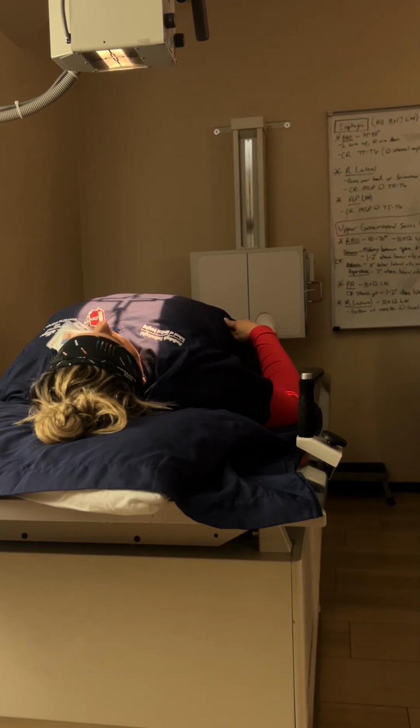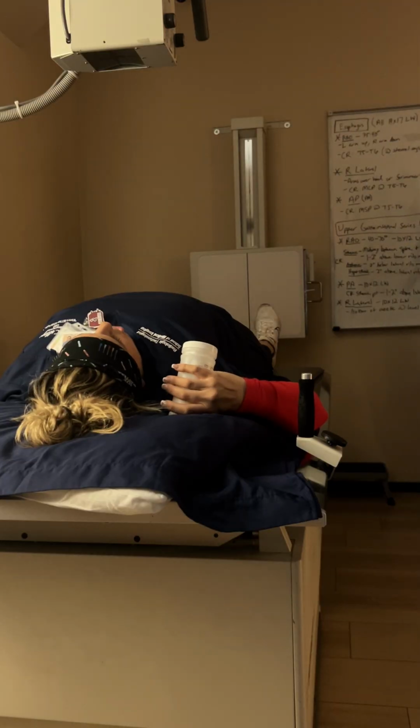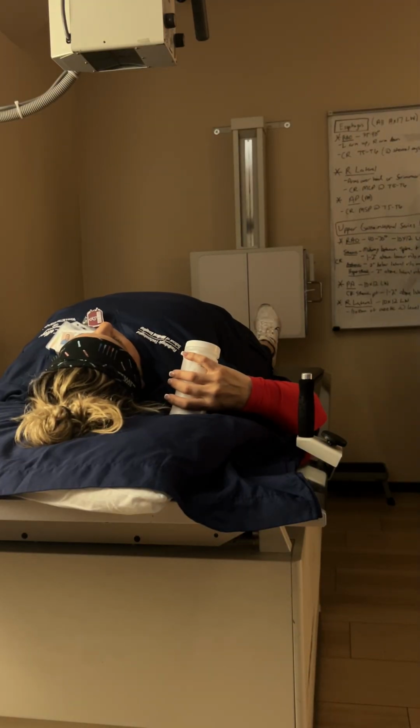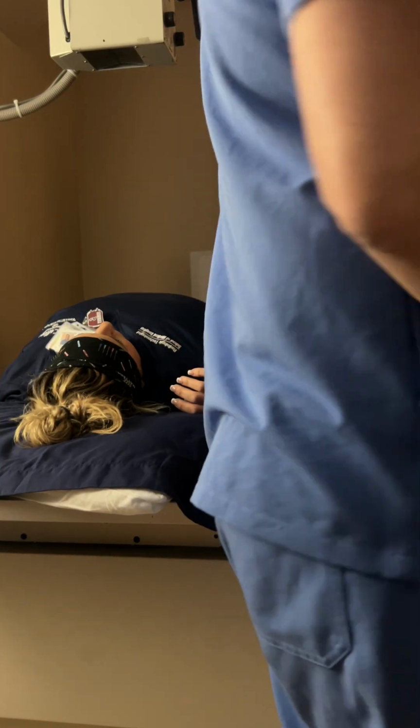Okay, great. And then I would have her turn her head this way slightly. She would hold this awkwardly with that hand and then take some sips while I'm making my exposure. Okay? Easy peasy? Could be worse, right? There could be all kinds of angulations.